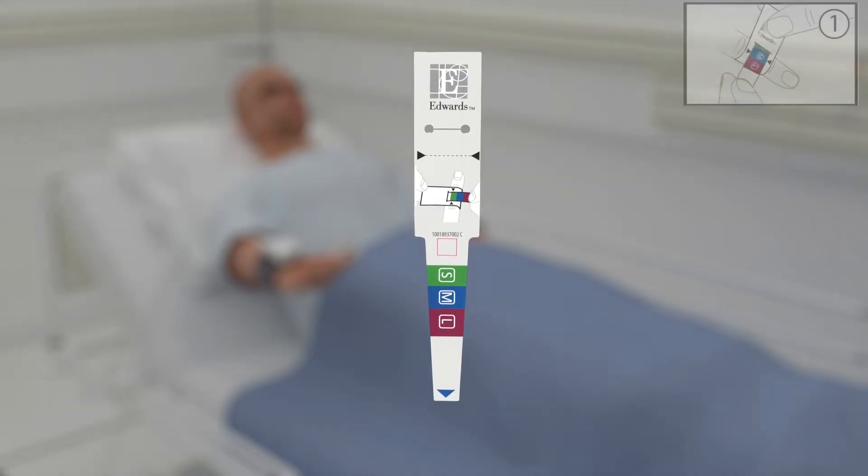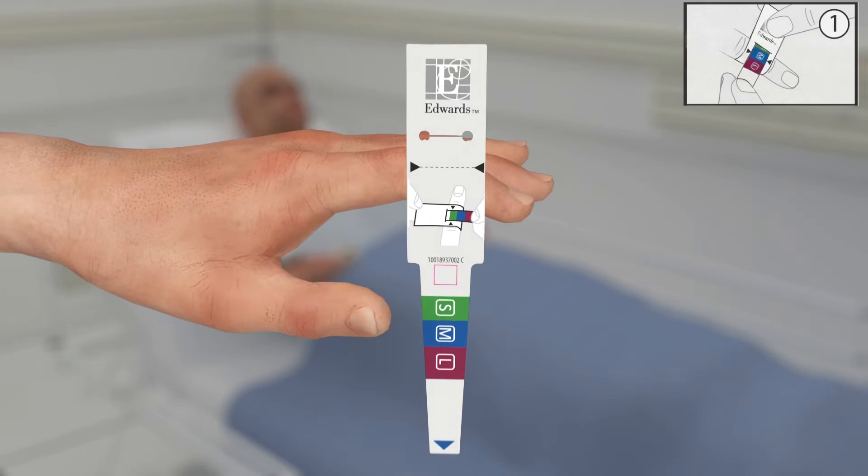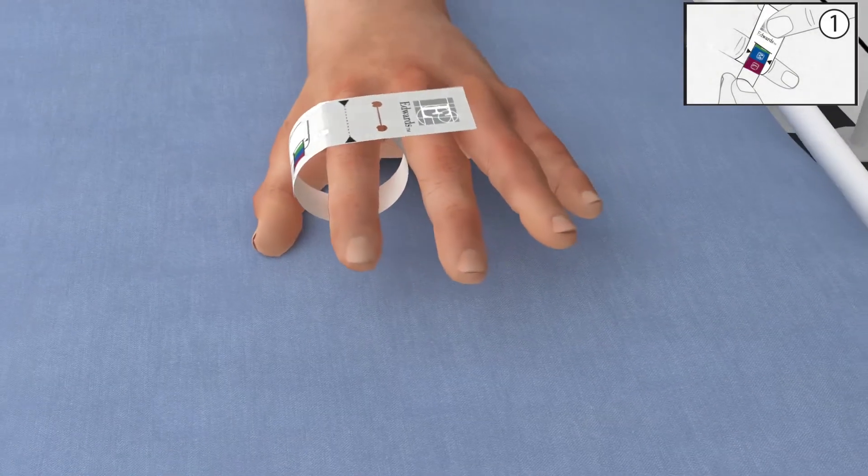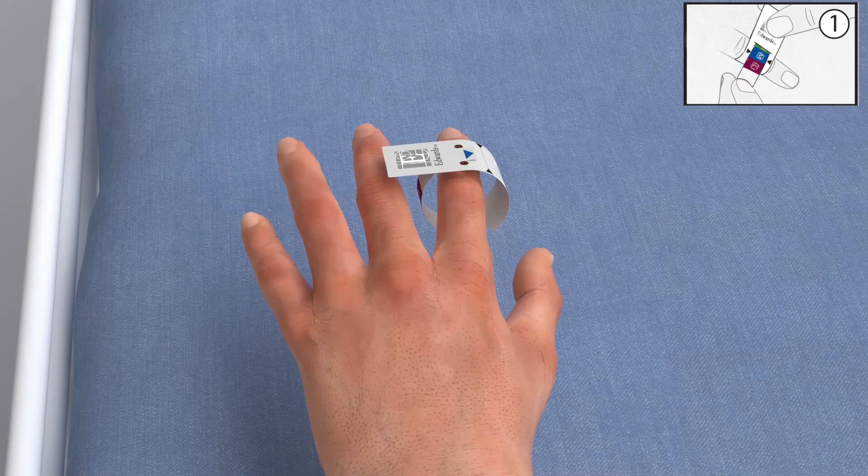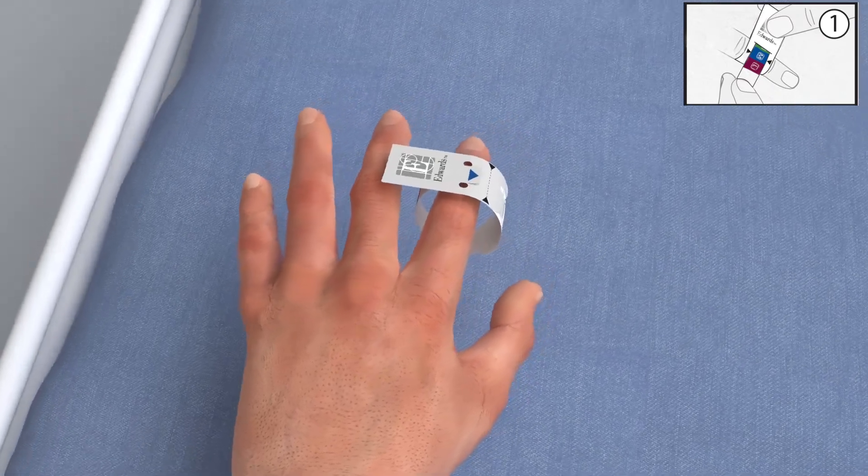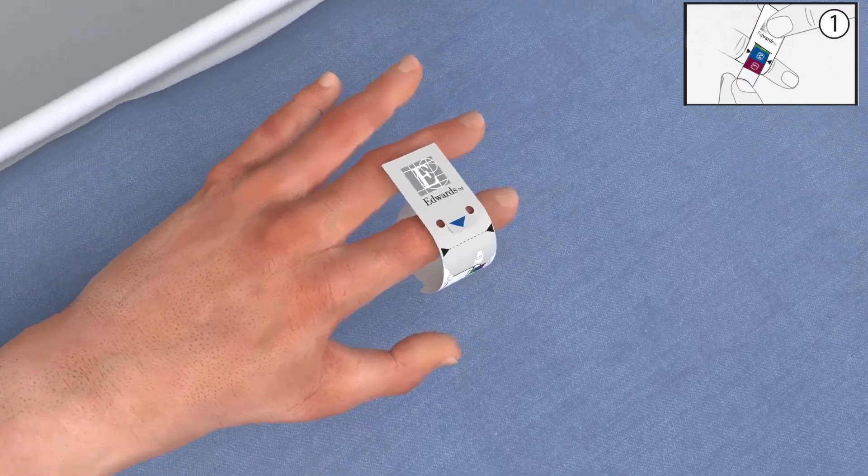First, use the AcumenIQ Finger Cuff Sizing Aid by wrapping it around the middle phalanx of the index, middle, or ring finger of the patient. Pull the smaller end of the color-coded aid through the slot until snug.